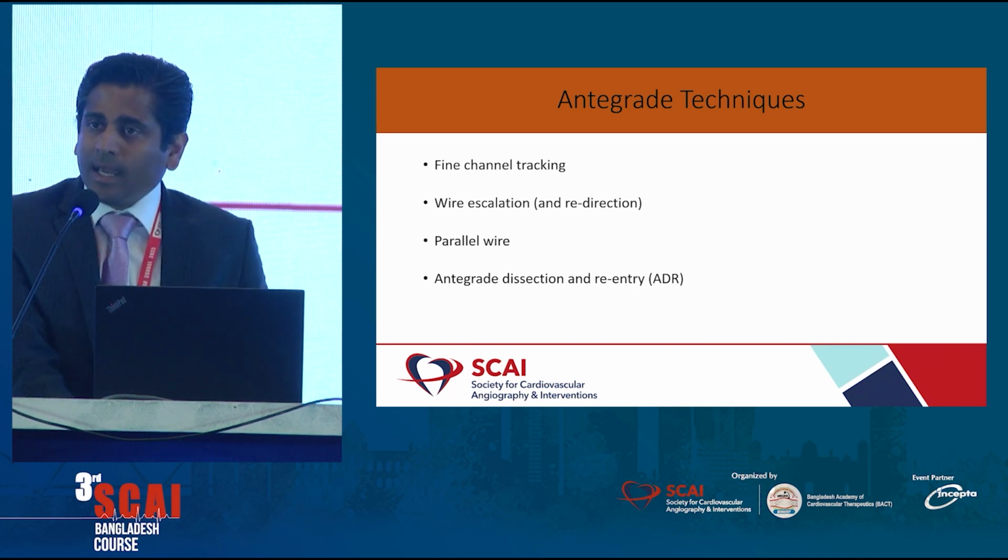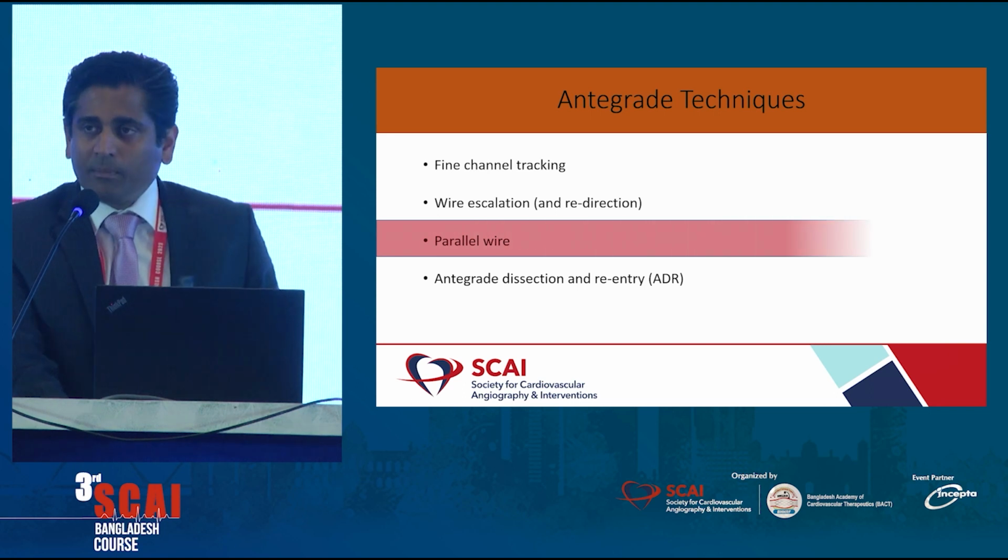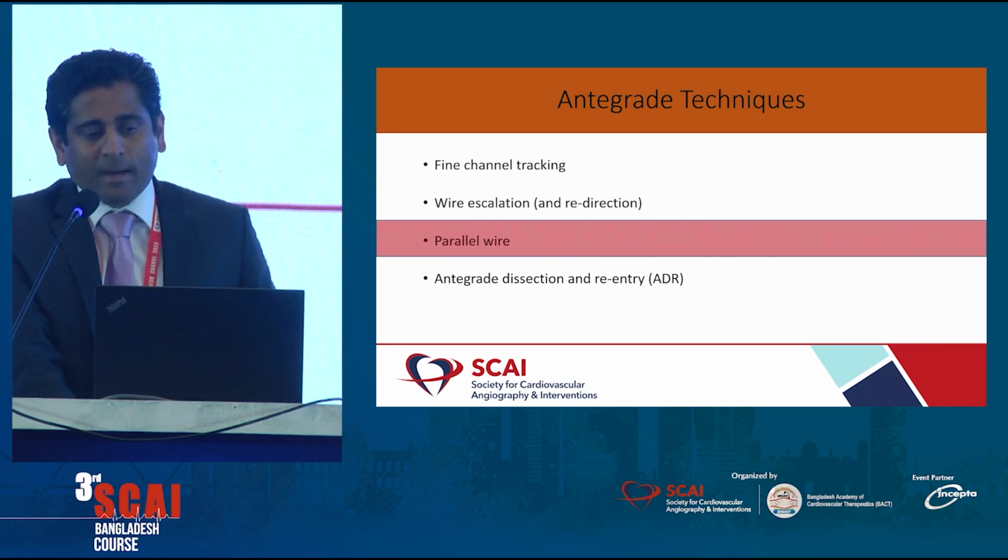So for example, if you're going towards subintimal, then you can redirect the wire at a different angle. If it's not working, then we choose parallel wire. And then there's something called ADR. So my topic is to just speak on parallel wire.